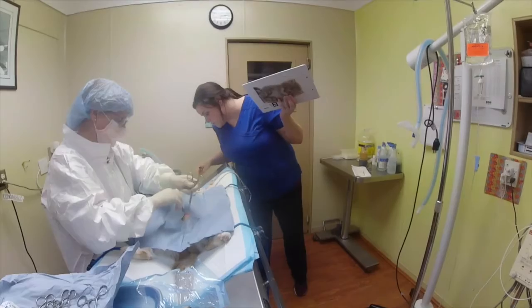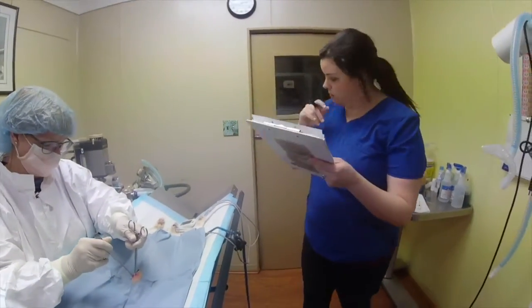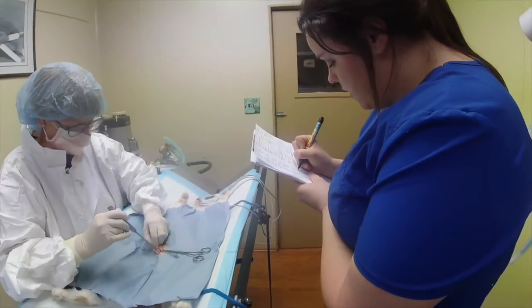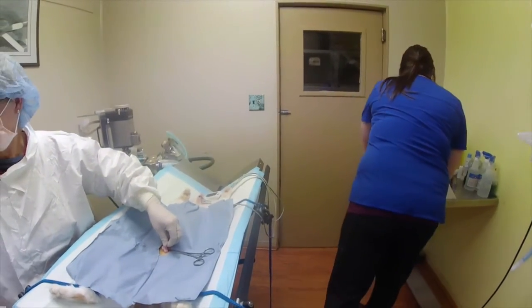Her monitor is reading 88 to 90 heartbeats per minute. So I will write that on here, and then we'll also do direct contact to confirm.